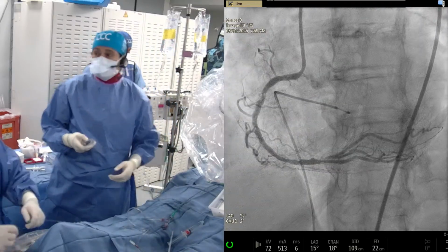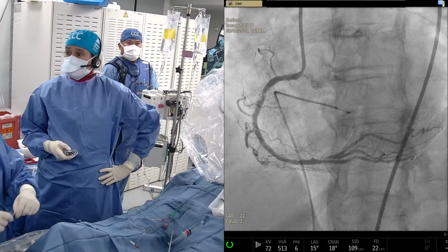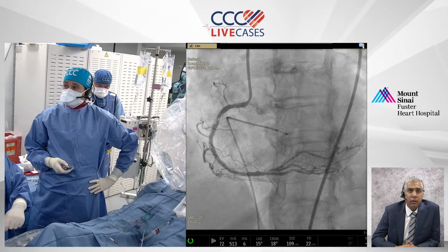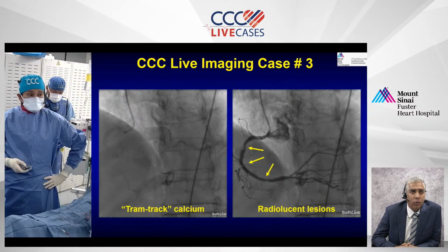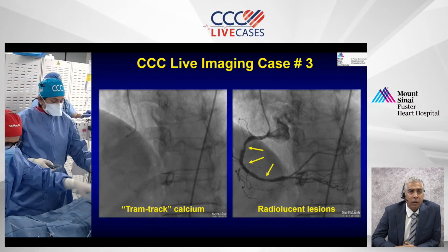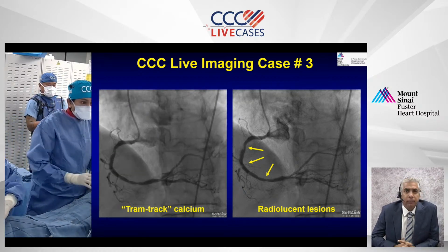I think you can change it. That's a great case. It's a kind of bread and butter complex case. It's the kind of case that most of our viewers would probably engage. It looks like the reflux is pretty good, so the hypotension was more related to the tip position, huh? Yeah, that's what we think.